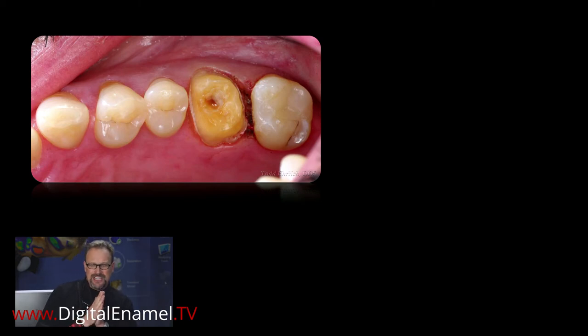Then the lovely Omnicam came out. I'll never forget 2012 when it launched. Me and James Clem and Paul Homily were lecturing around the country talking about the great attributes of it - because we didn't need powder. No powder, color-based. Everyone was so excited. It was a blast to use. This case shows how it struggles on some shiny areas, but there isn't anybody who converted from a blue camera to Omnicam that would have gone back.